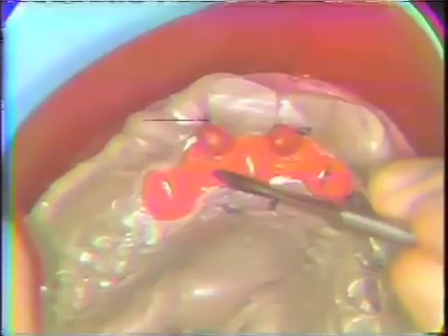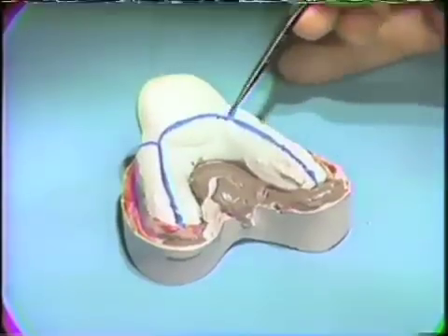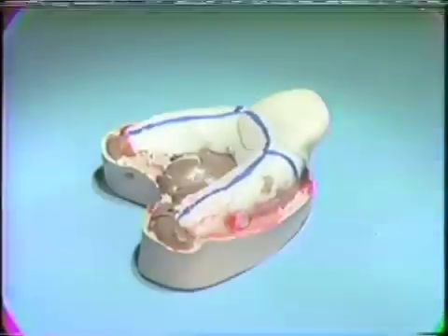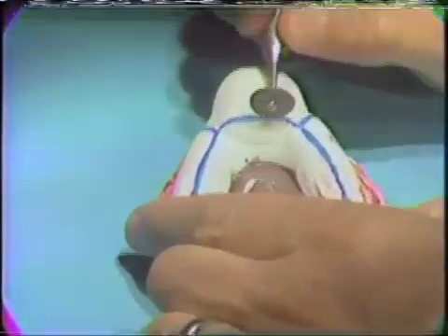This impression will then be poured in Velmix and then separated. The former tray will be removed by cutting along the blue lines outlined on the former tray, using a separating disc. The former tray will be sectioned so each section can be removed easily. Another way of doing this is burning the former tray off and pulling the rubber off with a pair of pliers. It is important when you cut the anterior part that you do not cut through to the dies.